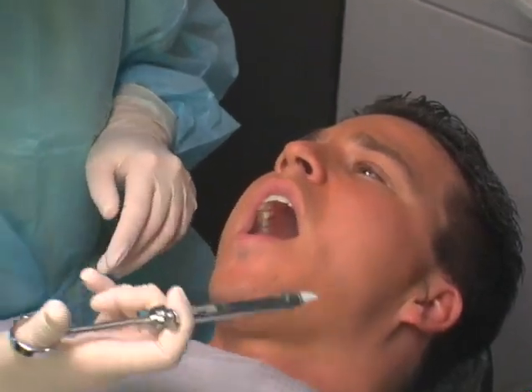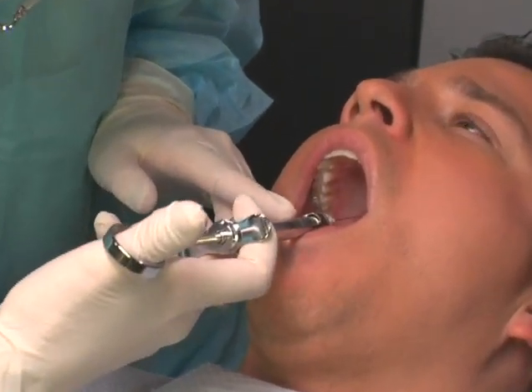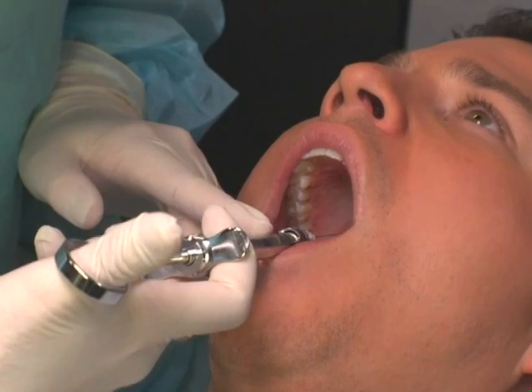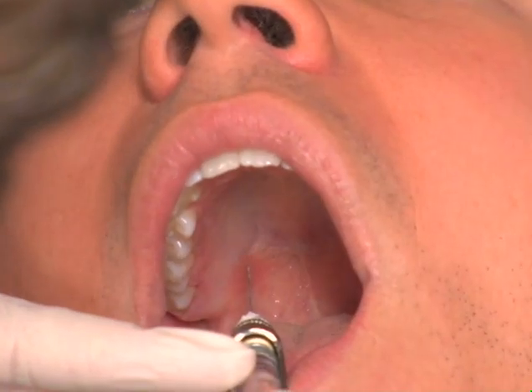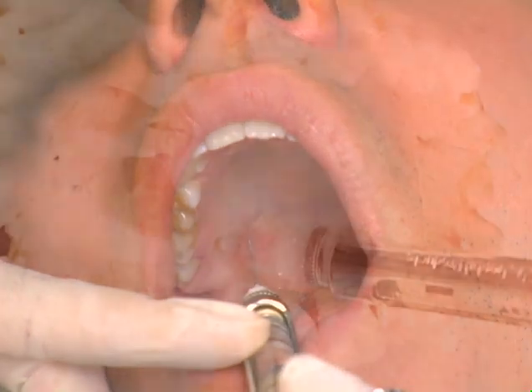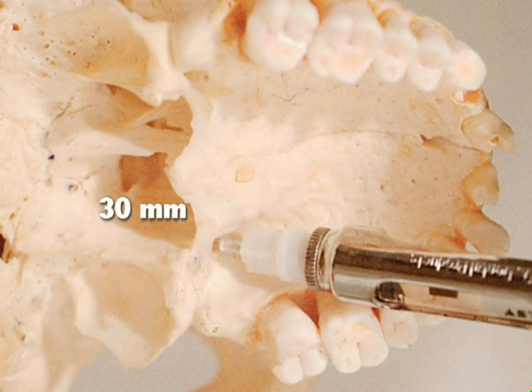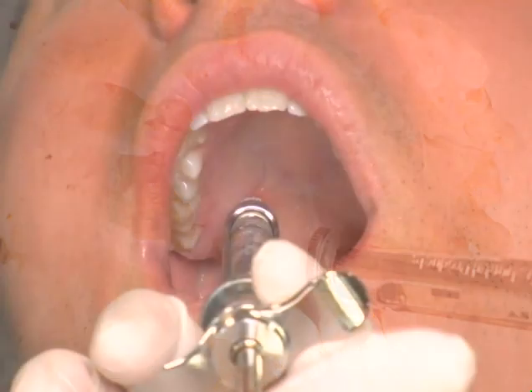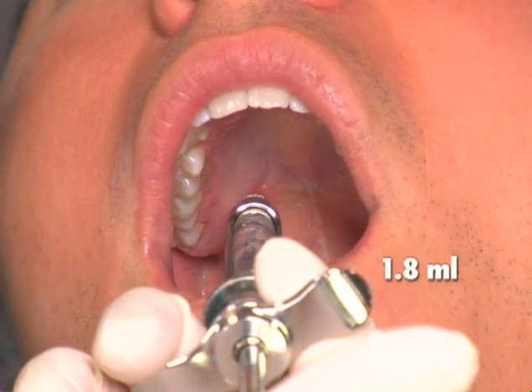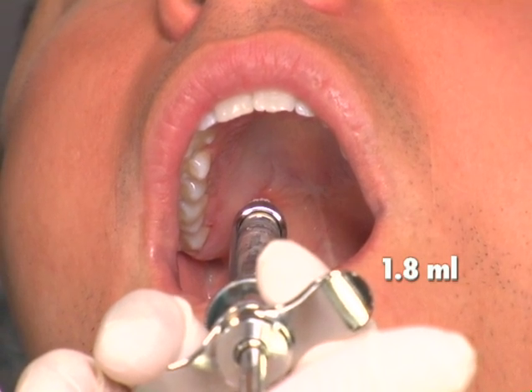Following completion of the greater palatine nerve block, the needle is inserted into the soft tissues over the greater palatine foramen. The needle is inserted into the greater palatine foramen and advanced to a depth of 30 millimeters. Following negative aspiration, 1.8 mL of local anesthetic is deposited slowly over a minimum of 1 minute.